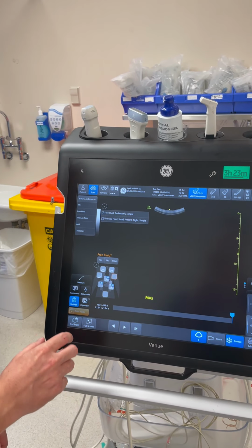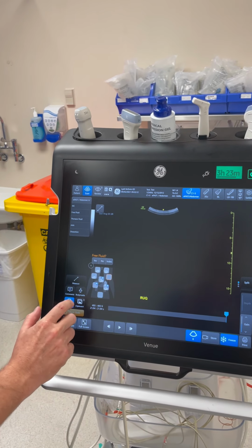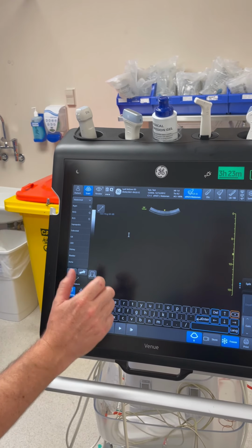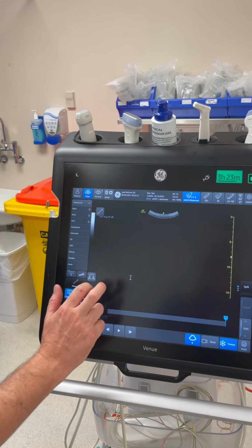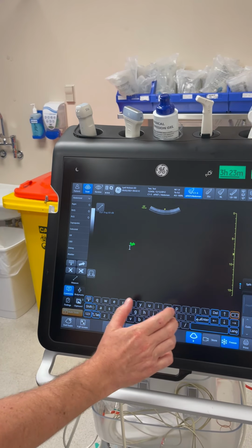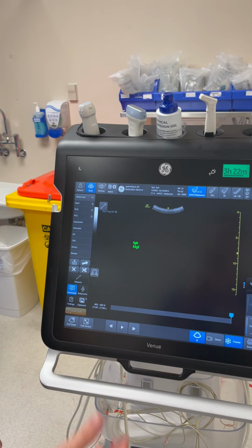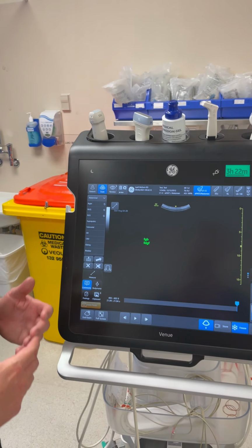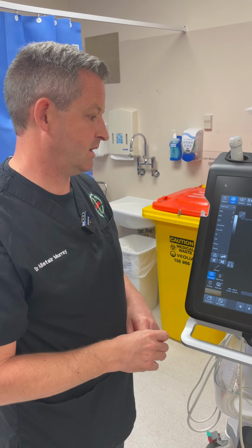The final alternate that you've got is that you can just have a frozen image. We'll get rid of these. We'll go to comments. We'll clear all our comments, and you can just move your cursor to here. And sorry, I'm going to take it off and back on. If it doesn't, you can just write your free text of what that is and store that image as a frozen free text image. Gives you a little bit more freedom to describe things without it fitting within the template that's there. And that's it.